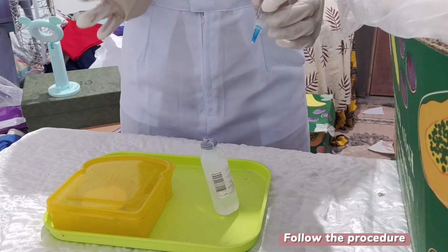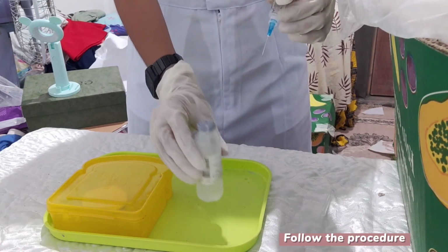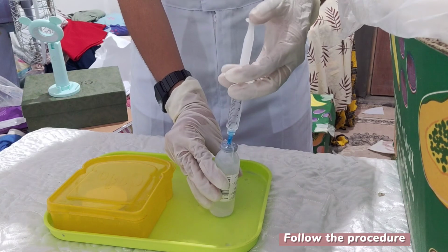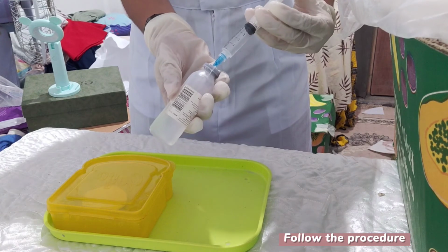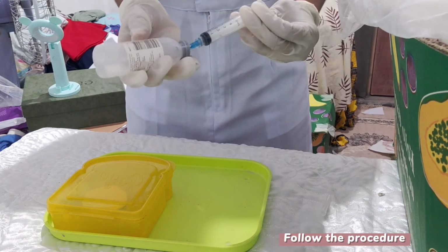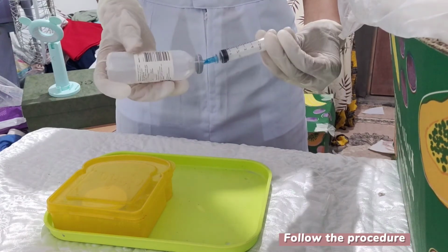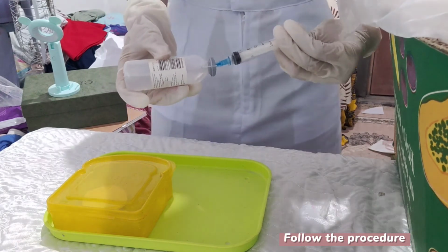Now we will insert the syringe into the vial. Make sure the vial is on a flat surface. We will insert it like this. And now we will inject the air into the vial. Now it will aspirate automatically. We need it at eye level to measure the exact dosage that is prescribed.